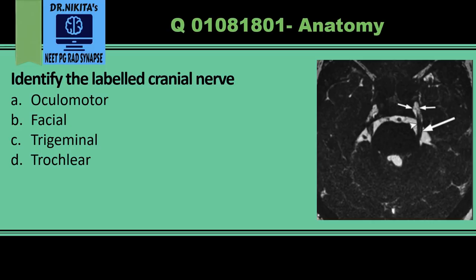In this image, there is an arrow pointing to this nerve. We see that this nerve is a thick nerve — it is not a thin nerve. Second, it is arising from the pons. This is the pons, which is in front of the fourth ventricle, and this is the cerebellum.